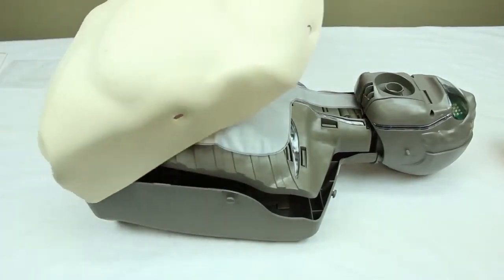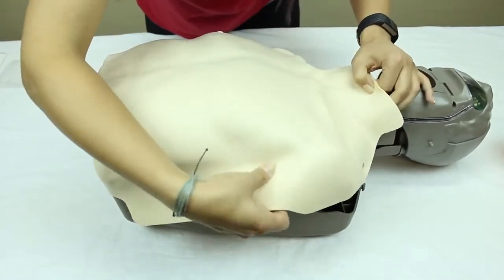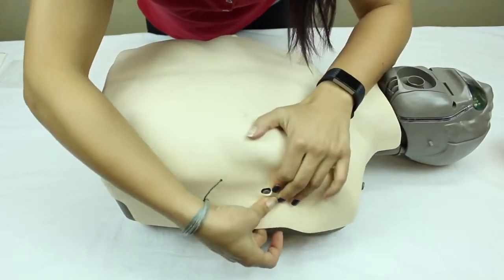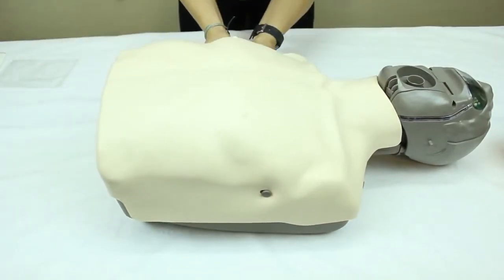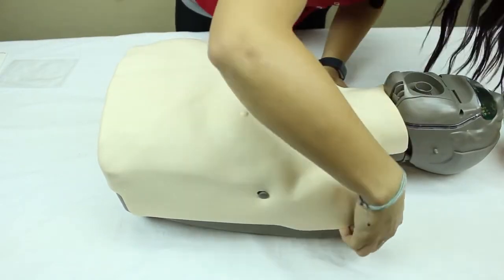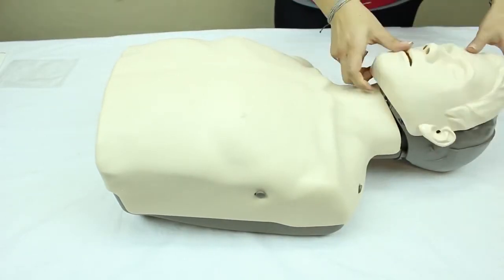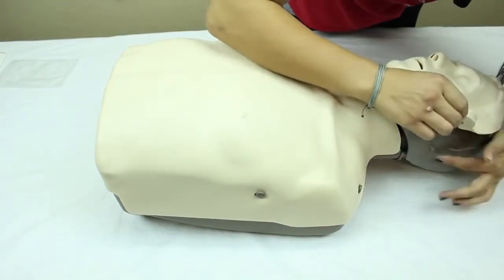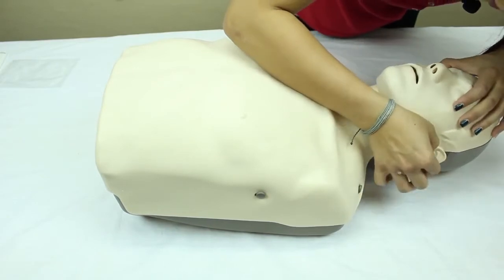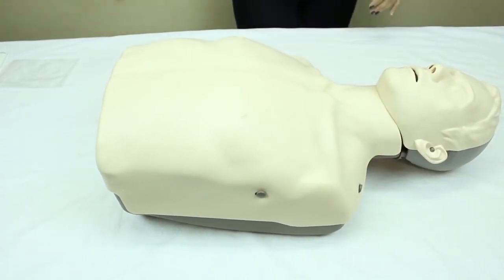Replace the skin back on and attach it to the knobs on either side, the shoulder area, and the face. Put the little knob in the ear hole. Skin's back on.